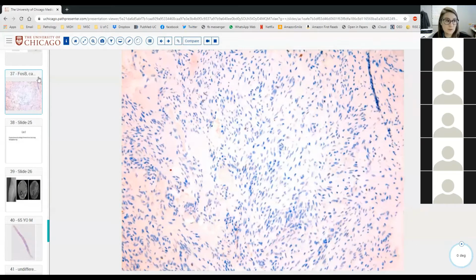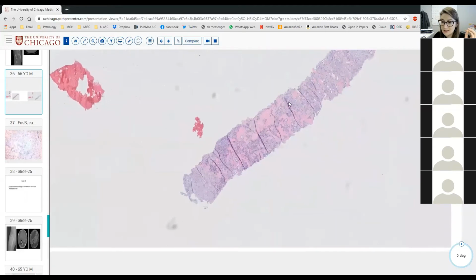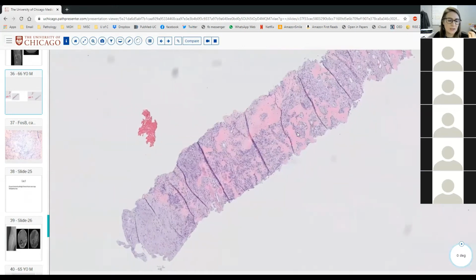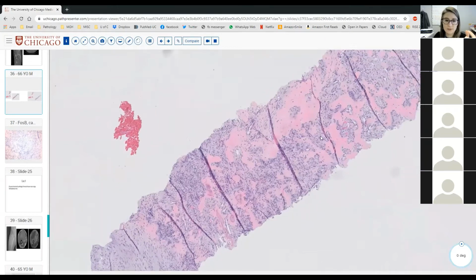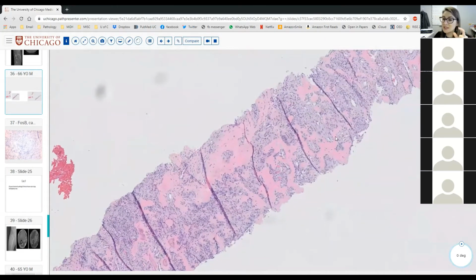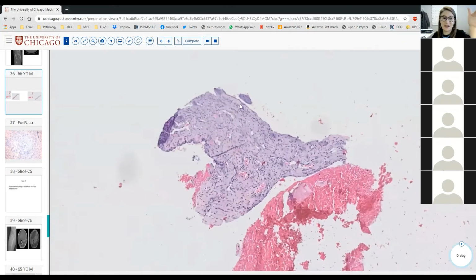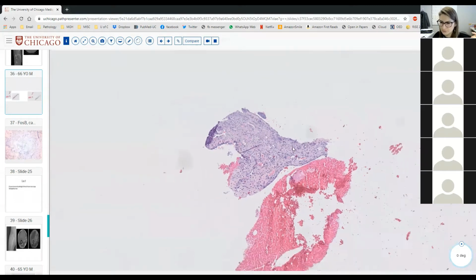And yes, this did have a USP6 gene rearrangement on FISH. So this is a predominantly solid aneurysmal bone cyst presenting in an odd location that's more expected for osteoblastoma. And so we use the immunostain and the genetic test to help us differentiate in this one. But don't forget that in the solid mural portions of ABC, you can get osteoid production like this. And so you really have to look around for other features that are suggestive, as in this case, that little guy jumping out. On MRI, you'd see fluid levels that would correspond to different ages of blood, right?